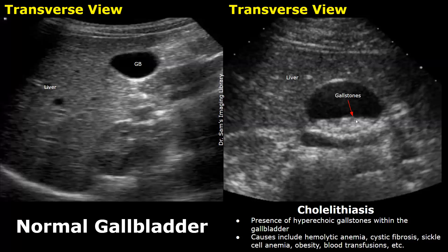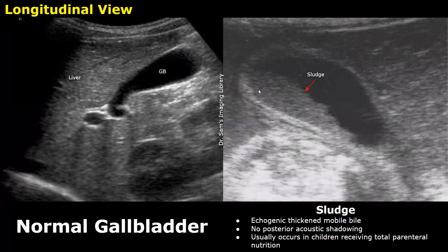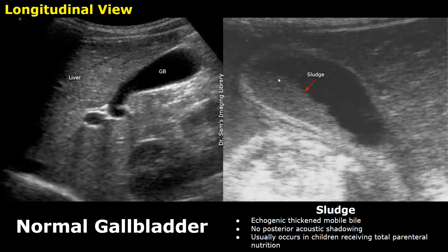Gallbladder sludge refers to thickened echogenic bile which is mobile. The sludge will not have any posterior acoustic shadowing, and its echogenicity is less than that of gallstones. Sludge usually occurs in children receiving total parenteral nutrition, in which the patient does not eat or drink through the mouth; instead, nutrition is given directly into the bloodstream using IV fluids.